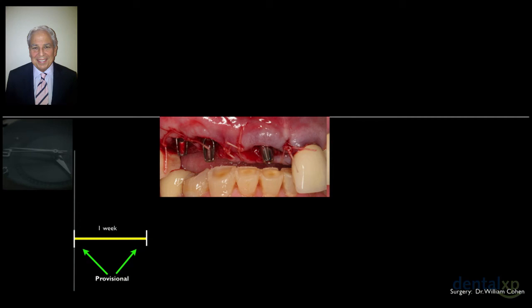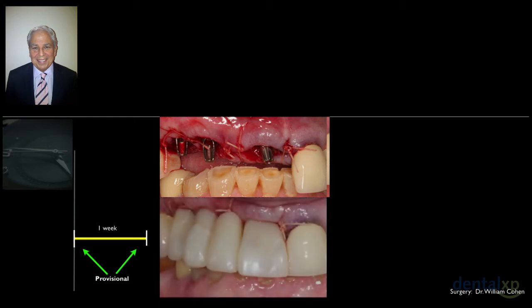And by the way, how far did we know to go subgingival? Well, because we had these abutments in the office, we placed the abutments on the implants at the time as he was putting them in, and based upon the clearance that we had between the coronal part of the abutment and the opposing tooth, we then knew how far subgingivally, or subcrestally, to go, and then could take off enough bone to accommodate that, so we wouldn't be too far subcrestally. Well, we take a look at that, and then we have the provisional restoration. So now we have two of the components of the ACT principle. We have the abutment, and we have a provisional restoration, the crowns that are going to be shaping the tissue.